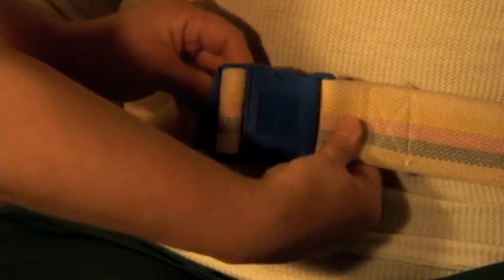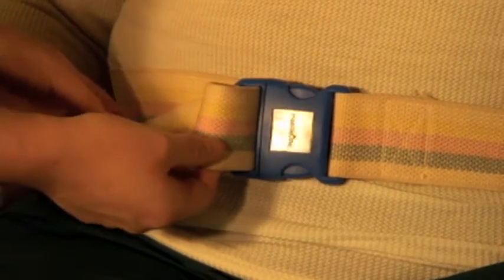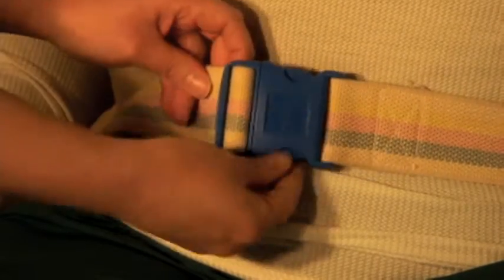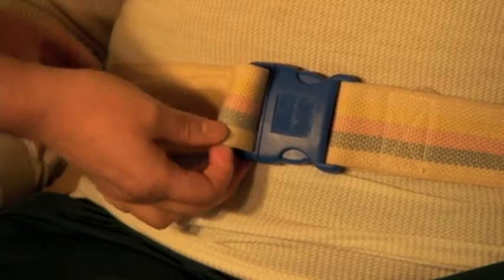Second, feed the end of the belt through the portion of the clip with teeth. Pull on the loose end of the belt to tighten it to the proper tightness. The belt should be snug to the person, but you should still be able to get your fingers between the belt and the person to grip.